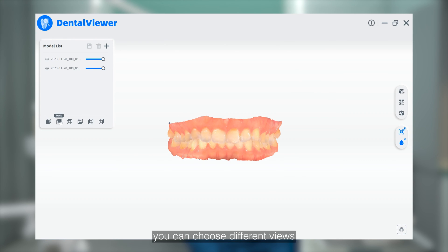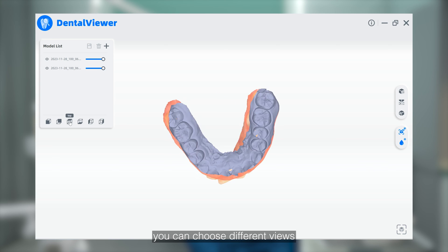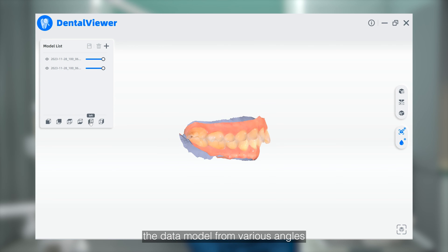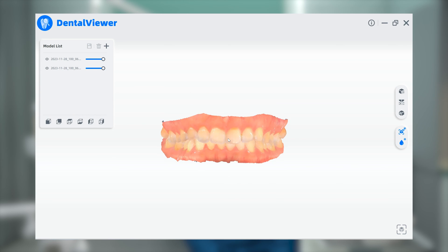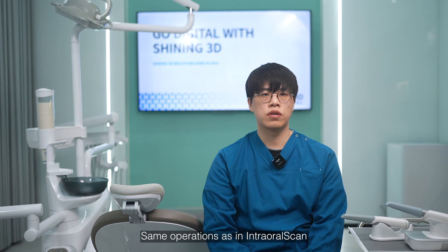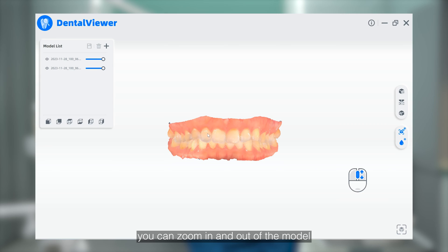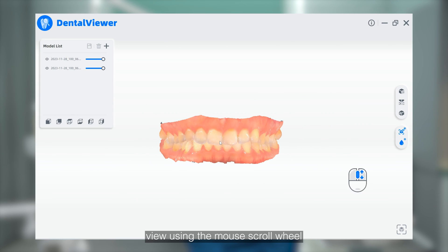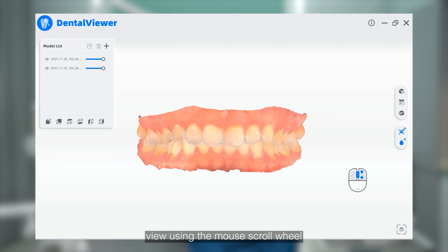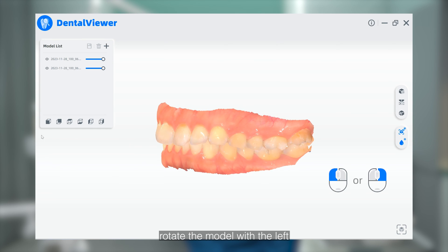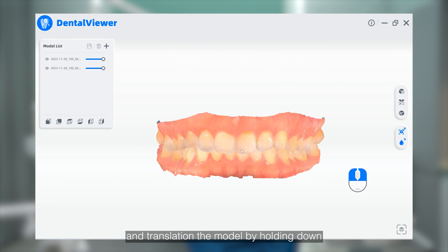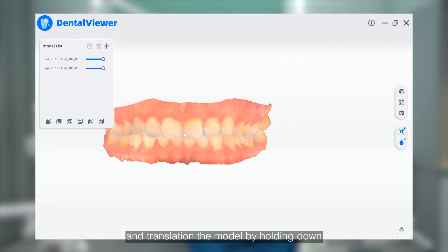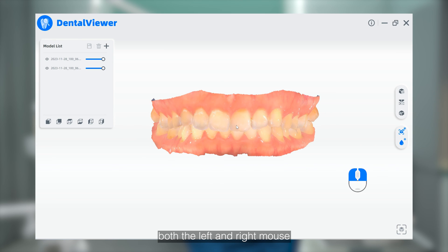In the model list, you can choose different views to easily examine the data model from various angles. Similar to operations in IntraoralScan, you can zoom in and out of the model view using the mouse scroll wheel, rotate the model with the left or right mouse button, and translate the model by holding down both left and right mouse buttons simultaneously.